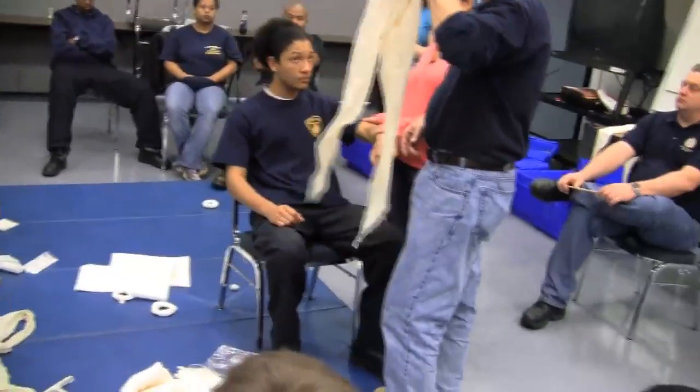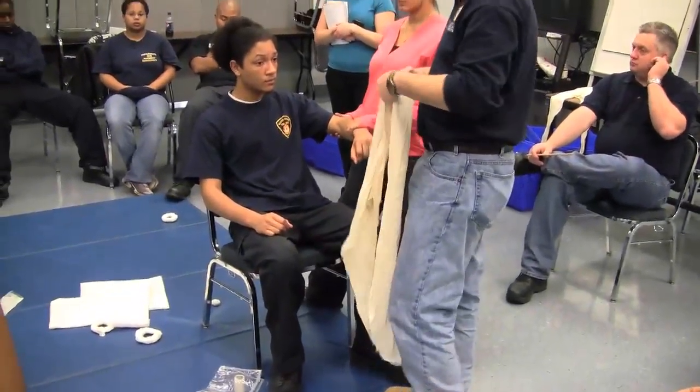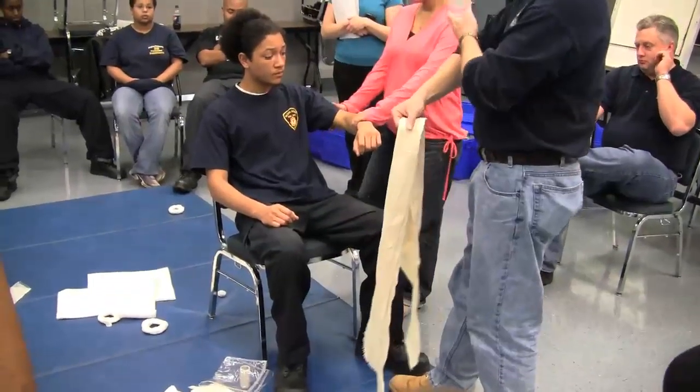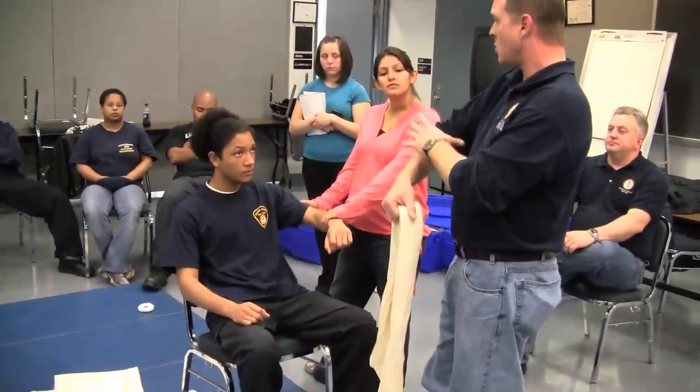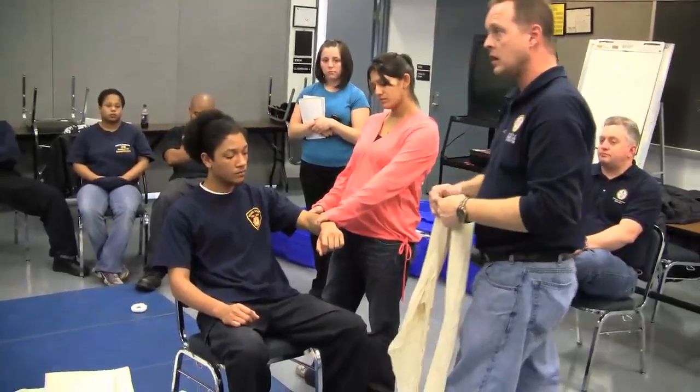Where would be the ideal place to have this? Below the joint. Later on, if a prosthetic is needed, they need the joint — like so. They keep the joint. This leg, we know it's not that. It's going to be better overall. It's the quality of life.